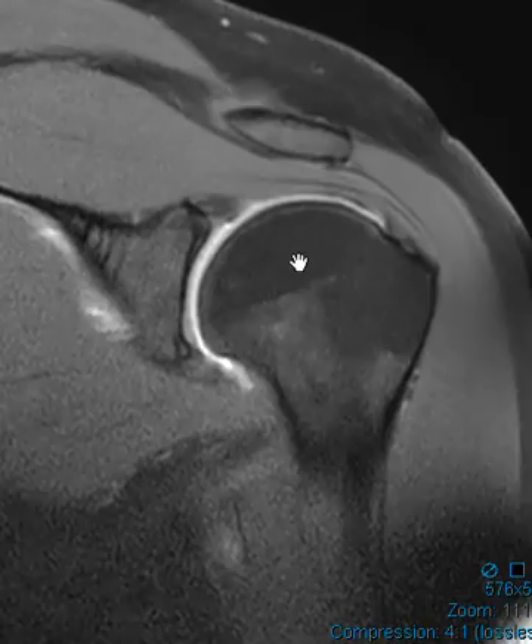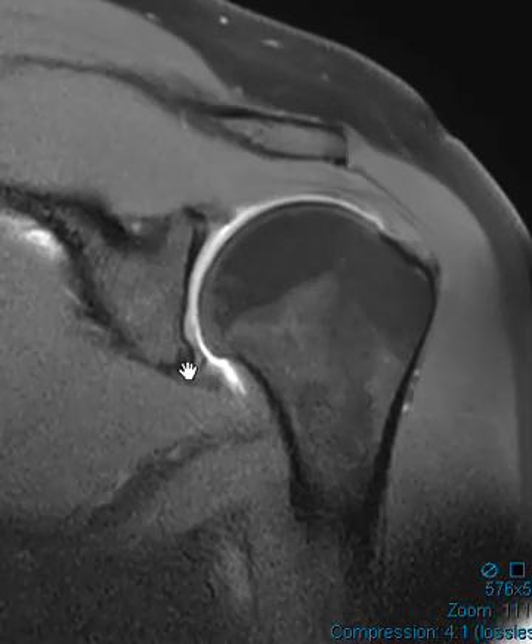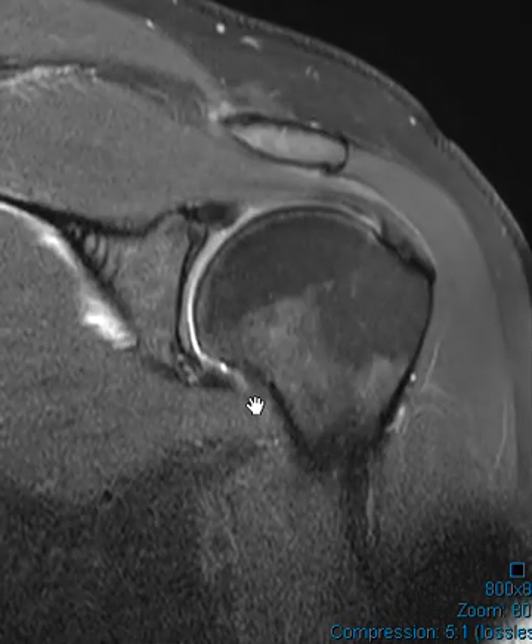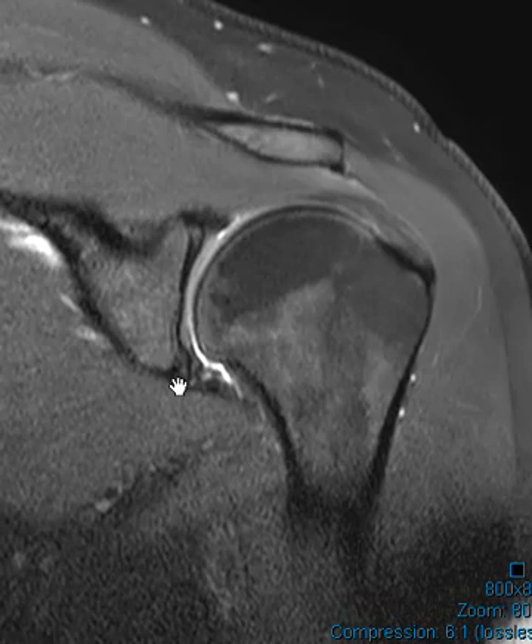Now this is the coronal T1 sequence. And you'd think this would be more sensitive, but I really can't see the labral tear here — it looks pretty good on this view. Here's PD fat sat, and actually you can see a little trail of brightness here. This is the inferior labrum, superior labrum, so this looks suspect down here.